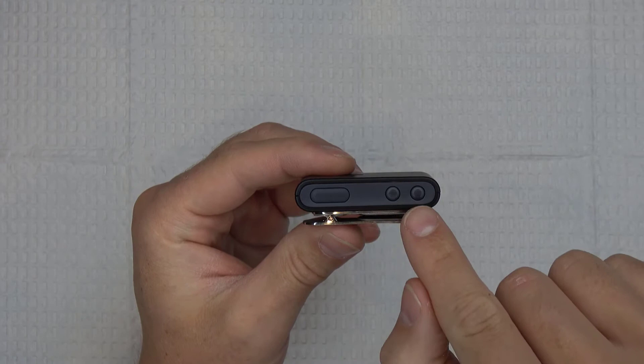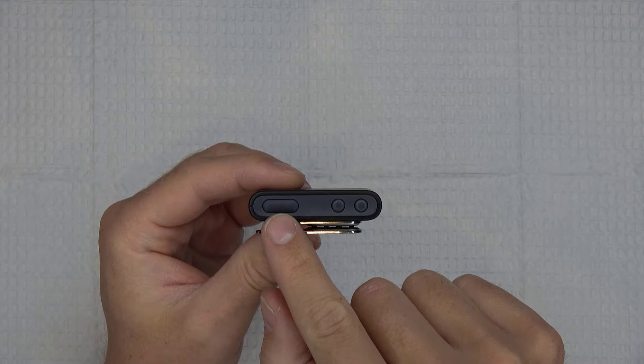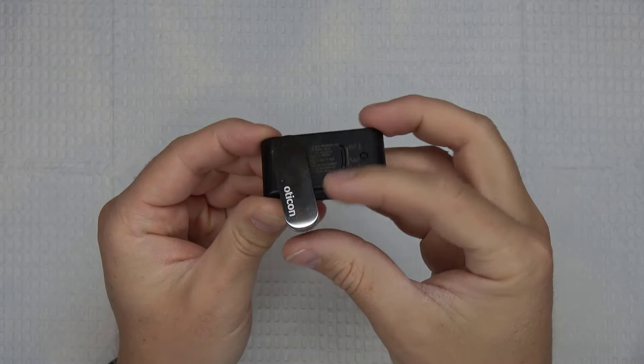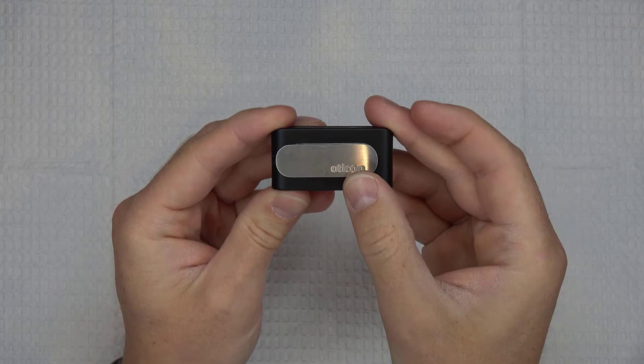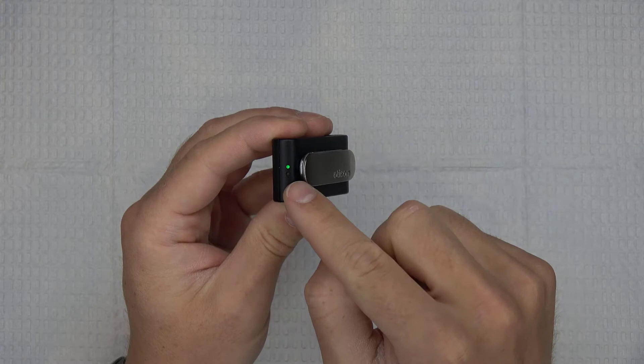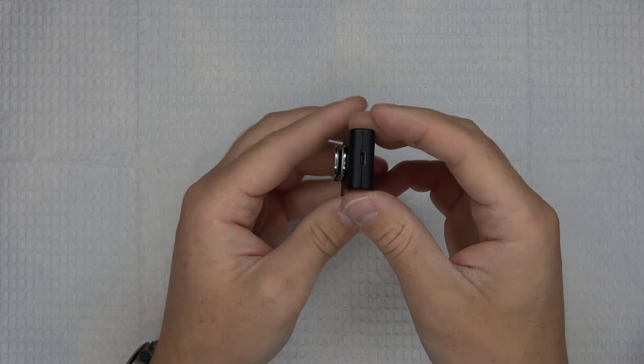On the side of the Connect Clip there are three buttons. The two smaller buttons are the plus and minus buttons, and the larger button is called the multi-button. The multi-button functions as the on-off switch as well as the button that switches the Connect Clip between different modes. On the back of the Connect Clip you will find the adjustable clip, which swivels side to side and allows you to clip the Connect Clip onto different articles of clothing or onto the lanyards that come with the device. To the side of the Connect Clip there are two indicator lights. When the Connect Clip is powered off these lights will be off, but when you press and hold the multi-button you will see the lights become illuminated.